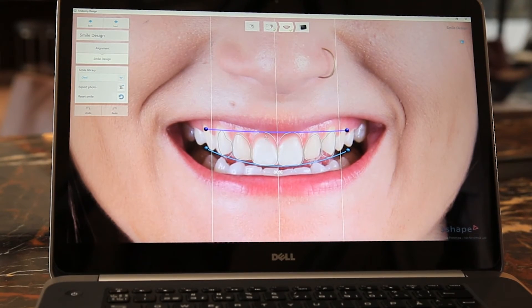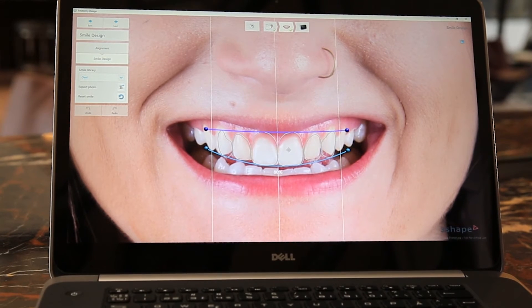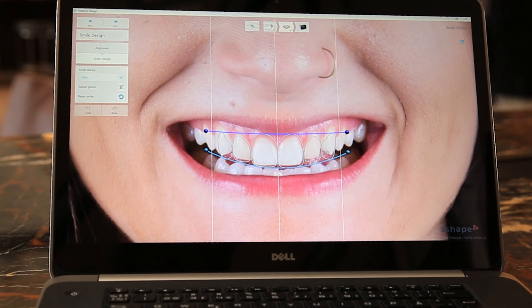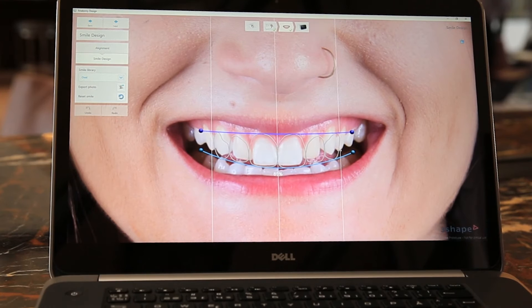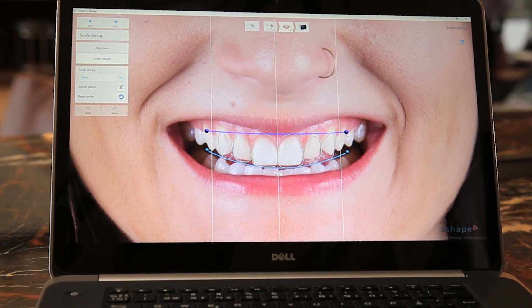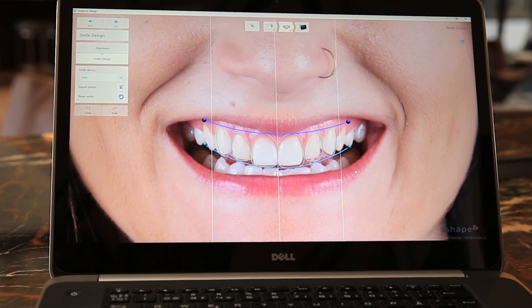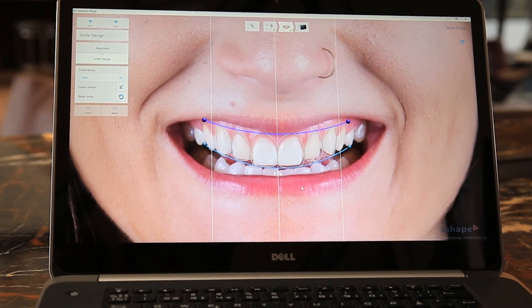Clicking next, it will zoom in on the photo and propose a digital smile design for me. It works using the interdental ruler, so I can scale here making sure the proportions are kept. I can also adjust the incisal curve and the gingival curve.